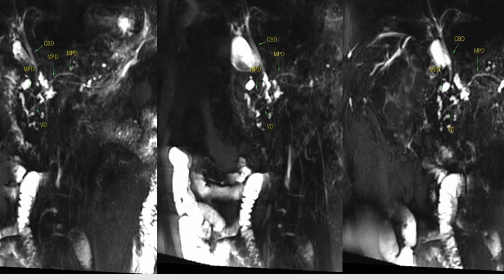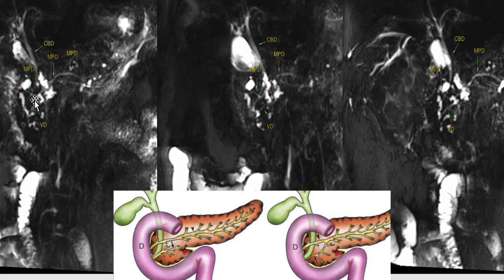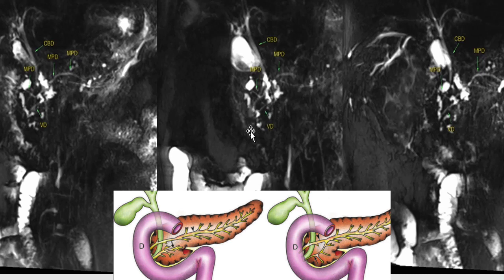These are thick slab MRCP images of a patient with acute chronic pancreatitis. The main pancreatic duct can be seen to cross the CBD and drain separately into the minor papilla. The common bile duct joins the ventral pancreatic duct and drains into the major papilla of the duodenum. The MPD is seen to cross the CBD and drain into the minor papilla, while the ventral duct joins the common bile duct and drains into the major papilla. These findings are consistent with pancreatic divisum.